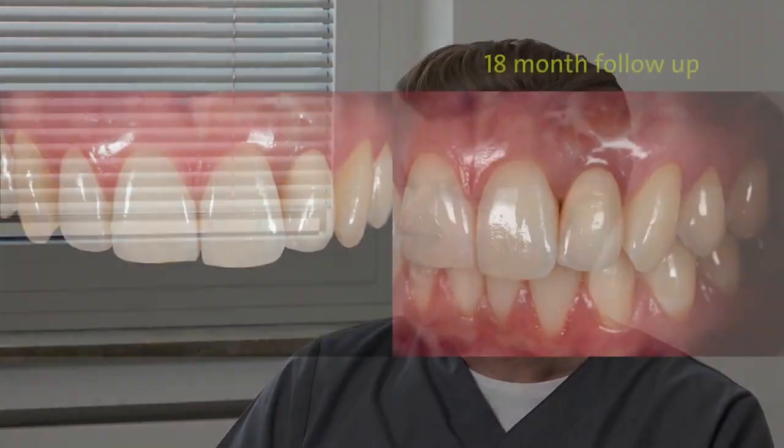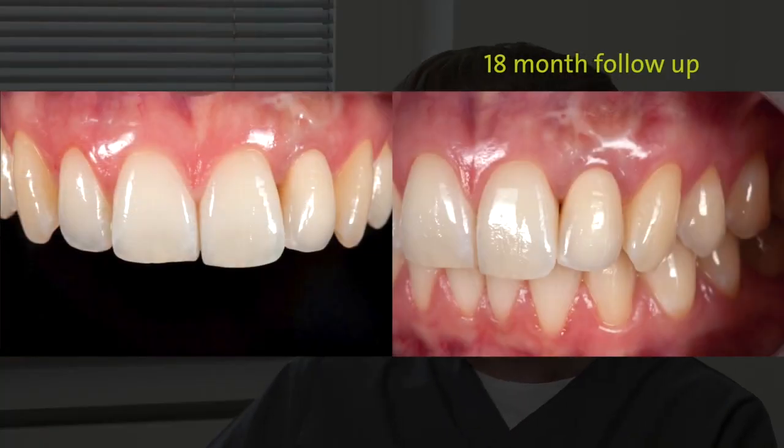Whenever it's possible we go for screw-retained crowns today, because we want to avoid excess cement that may cause peri-implant inflammation. Here you see the healing, and actually we now have a follow-up of one and a half years. The patient is very happy with the result — we have an aesthetically pleasing result and we don't see any inflammation or signs of inflammation of the soft tissue.